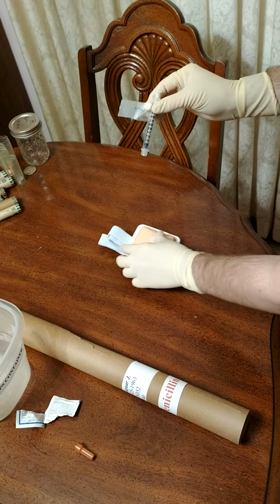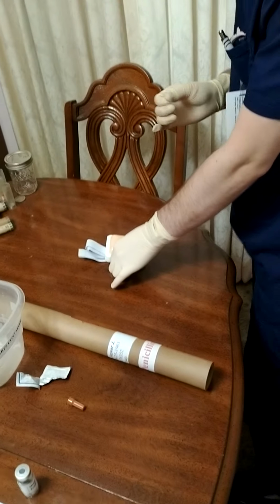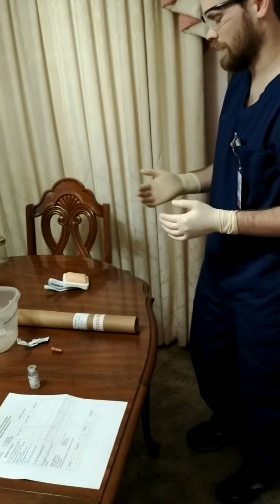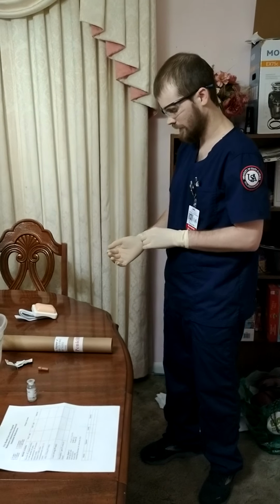Remove, and I apply gentle pressure and dispose of my needle into an appropriate labeled sharps container. I will then, before leaving the room, assess the patient to ensure there is no allergic reaction, there's no oozing or bleeding from the injection site.